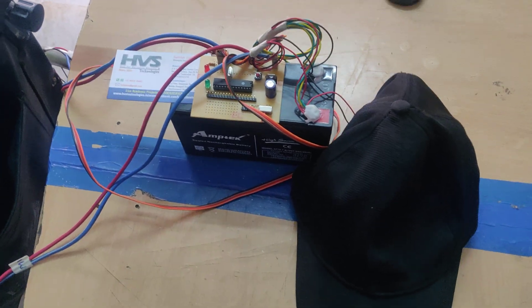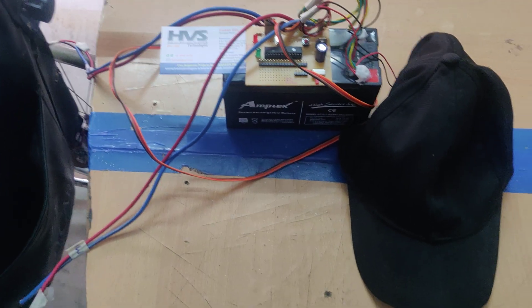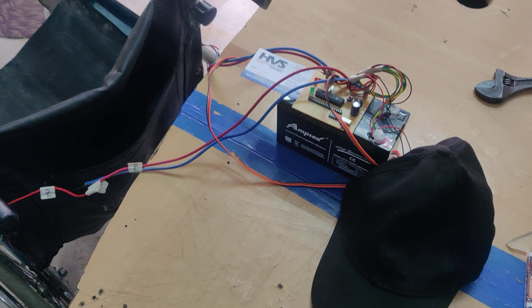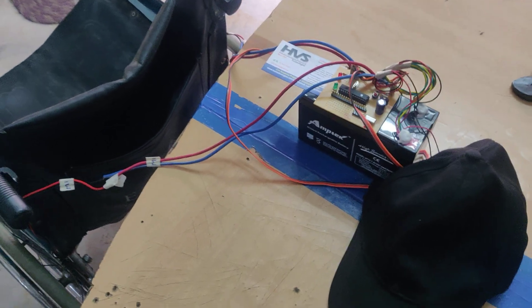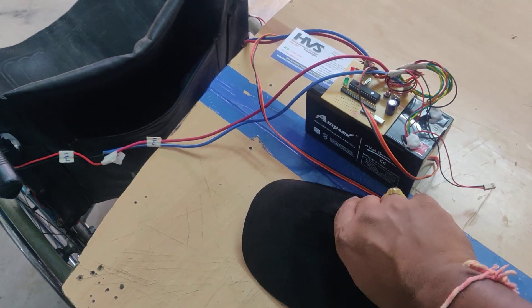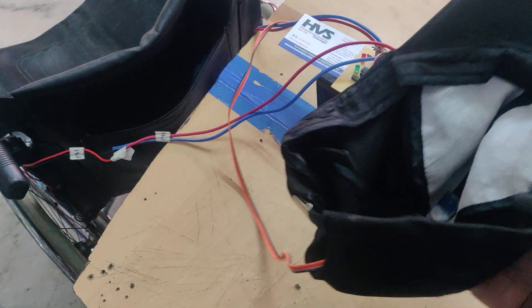Welcome to the project demonstration of a smart wheelchair based on head motion controlling. Here we are going to control this real-time wheelchair, which can handle up to 80 kilograms, in four directions: forward, backward, left, and right. These directions will be controlled through head motion, so to detect the head motions we are going to make use of a MEMS sensor.